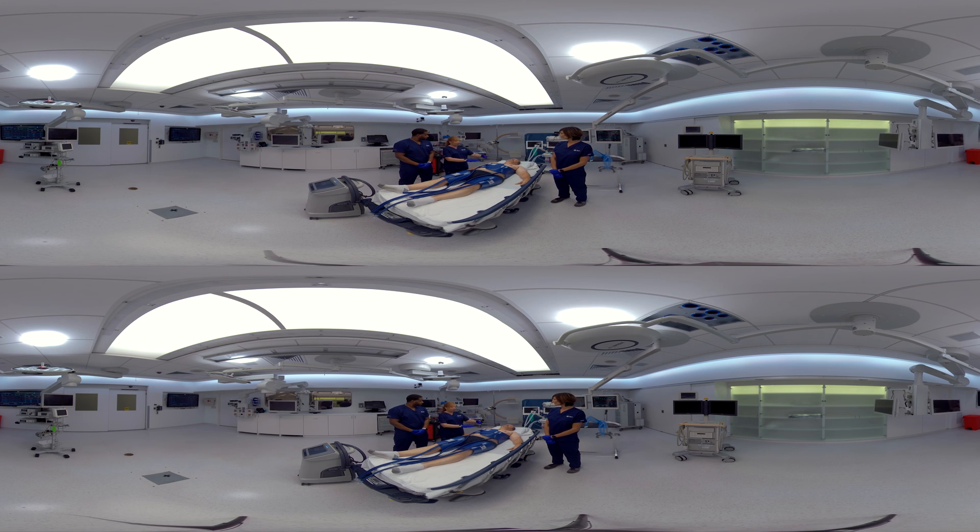You'll notice that our gel pads are overlapping on the abdomen. If you roll your patient over and there is a large gap of exposed skin, you'll want to get a universal gel pad. A universal pad is a supplement to the set of four gel pads on your patient. When you open the package, the pad looks like a rectangle and can be used to bridge the gap across the abdomen. You can use up to two of these.